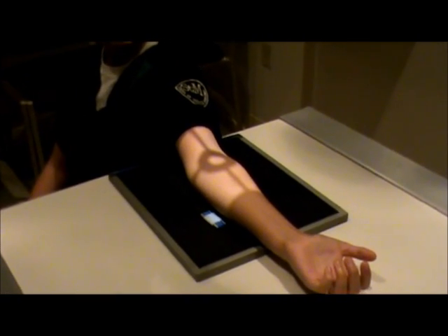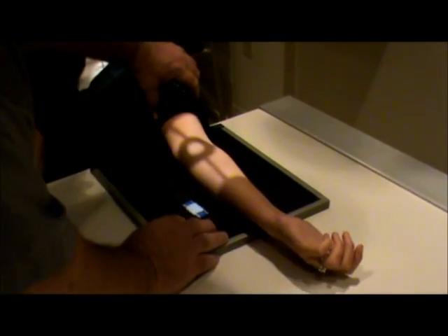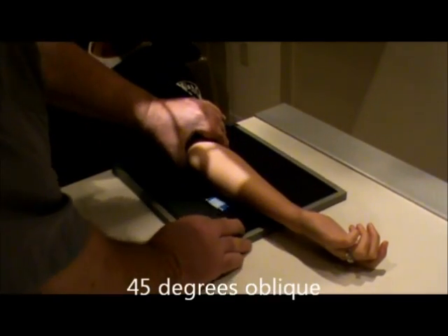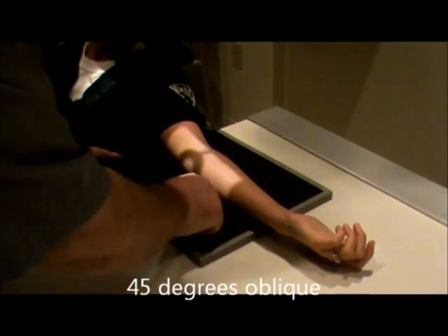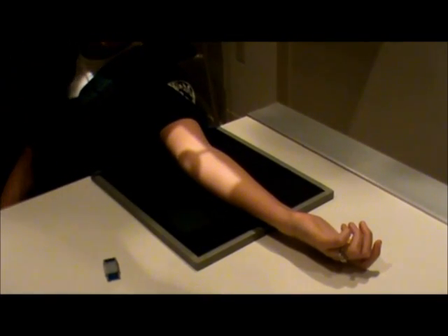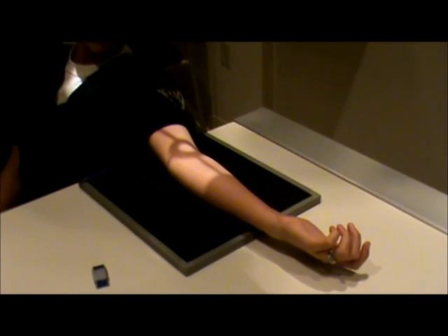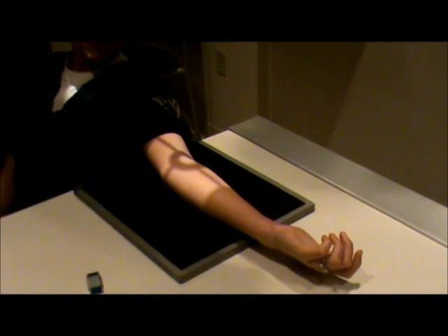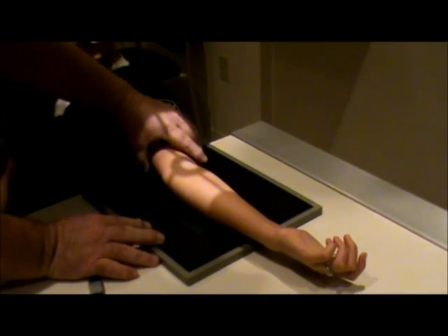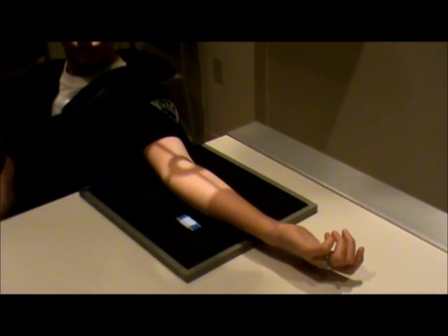Our next view is going to be the external oblique view. We're going to have the patient rotate their arm laterally, approximately 45 degrees, and again keep everything in the center of the film. This view will best demonstrate the radial head, neck, and tuberosity free from superimposition. We want to make sure that the marker placement is not obstructing any pertinent anatomy.